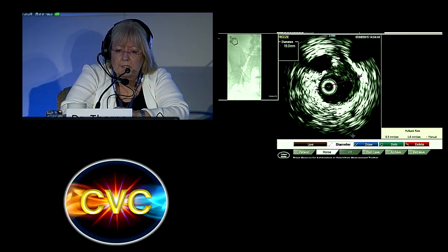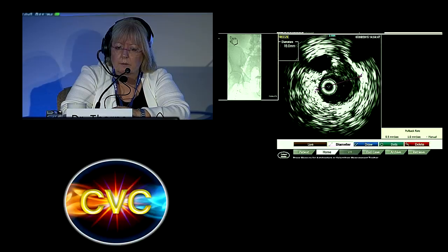Well, I've been saying all along that the balloon angioplasty doesn't really do the job, so I favor stenting it from my experience. What do you think, Doctor?